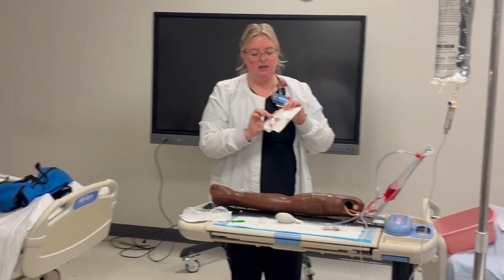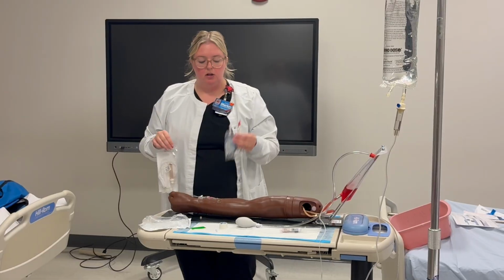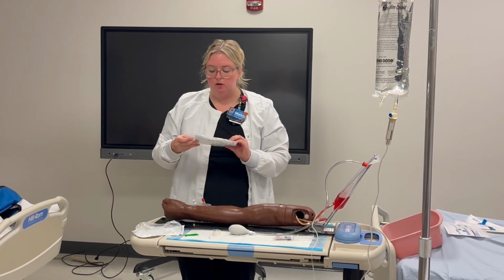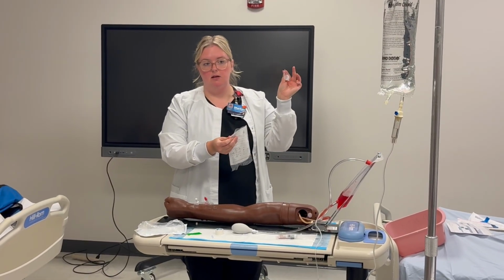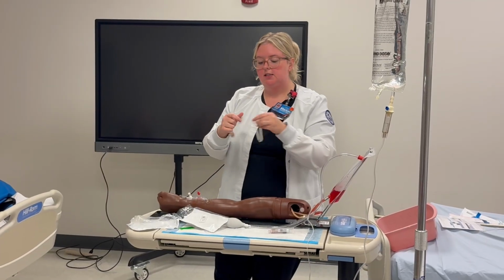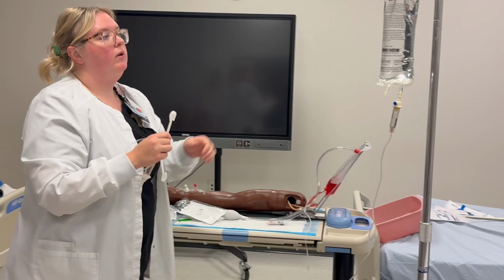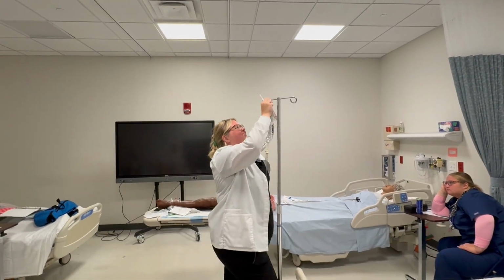So this tubing, it's much less, but it's basically the same process. You're gonna turn it upside down. We do our third check so that we know that we're safe and we're giving our patient the correct medication. This also opens easily from the top. One thing that's different is it's gonna come with this little extra piece. So you're going to lower your primary.